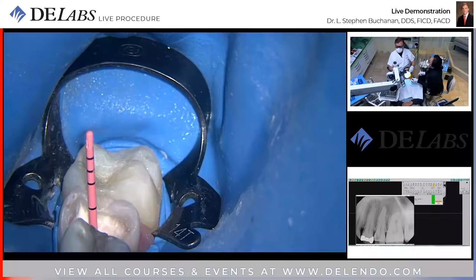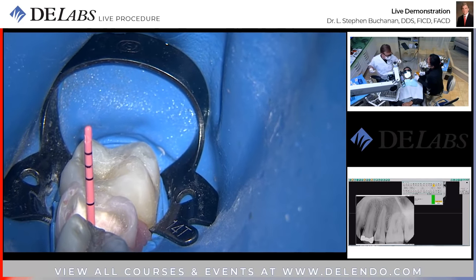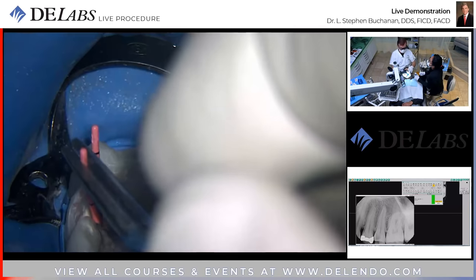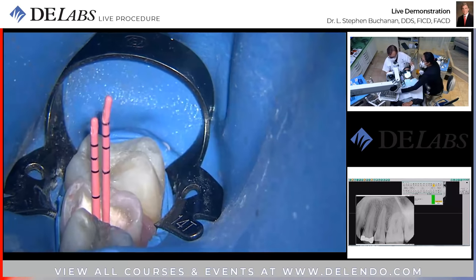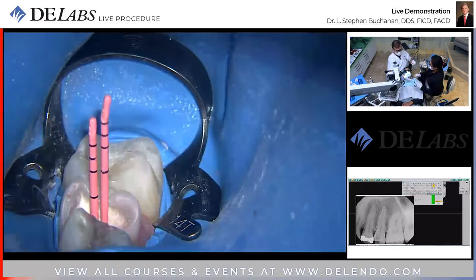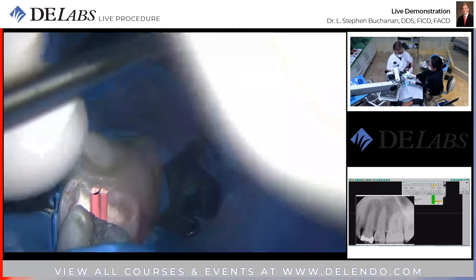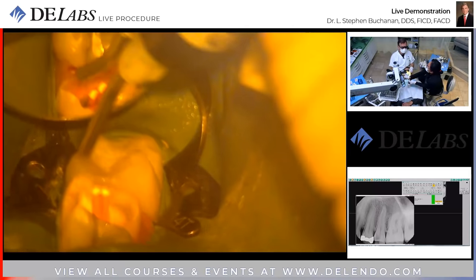So I'm actually going to put a couple in here because I've got a really oval canal in the coronal half. Rounds out as it gets more apical. Scissors? Scissors? Okay, there we go.